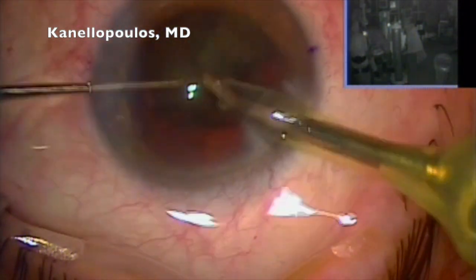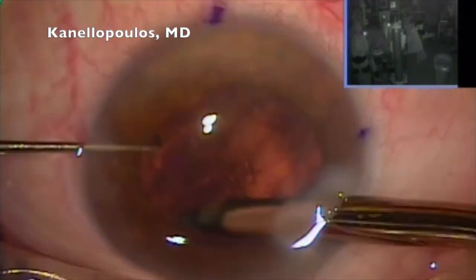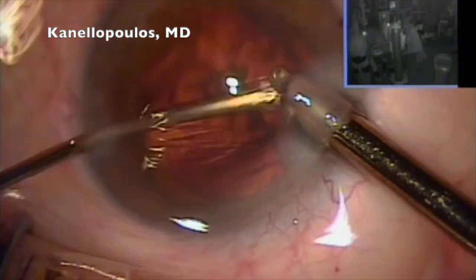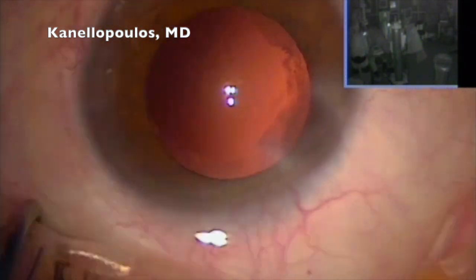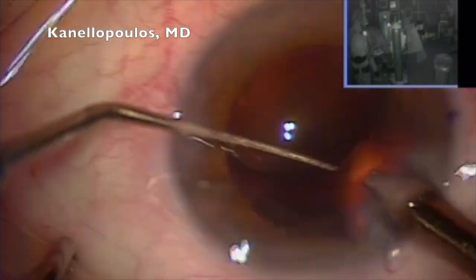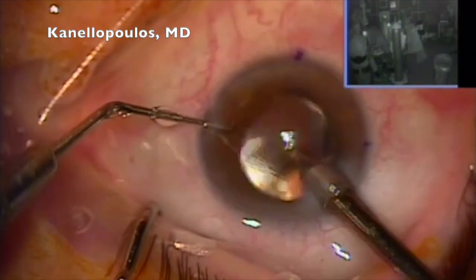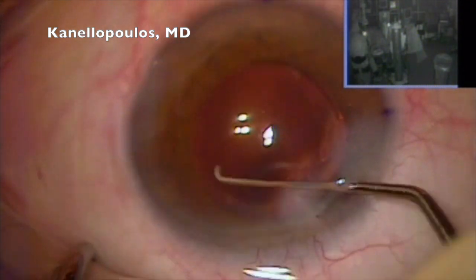We divided the lens in four. The second half is coming kind of in block after I refilled with viscoelastic — I want to underline that. Busy surgeons sometimes skip that point, and that's where you can nick the posterior capsule since you only have one piece and very little viscoelastic in the bag. Polishing the posterior capsule — non-methylcellulose, non-viscoid. Bring the lens in, roll it in the D-cartridge. Again, consistency is number one. Coming under the lens to remove the residual viscoelastic over the lens. Never underestimate this part — you don't want to have a patient with intraocular pressure of 40 the next day.